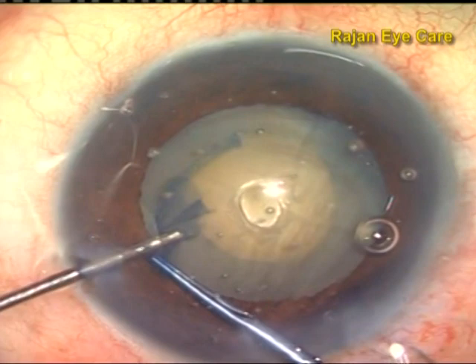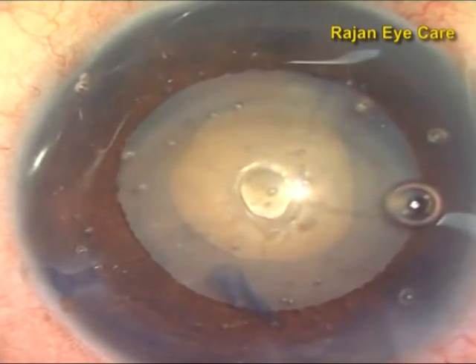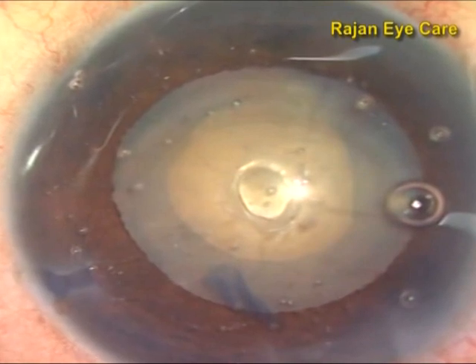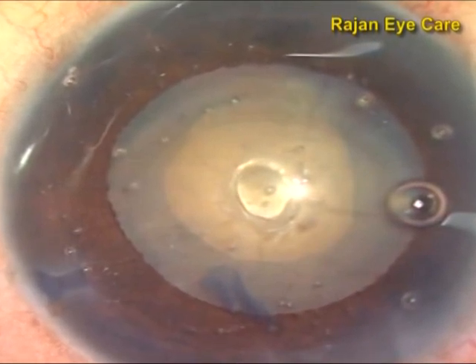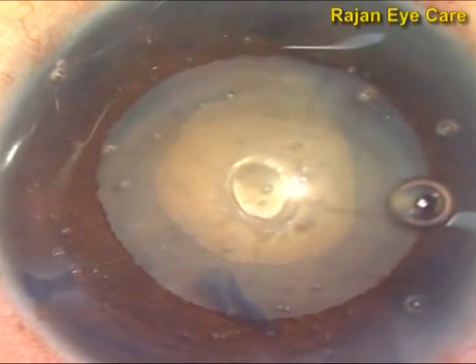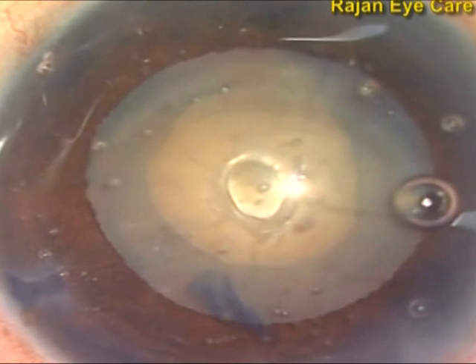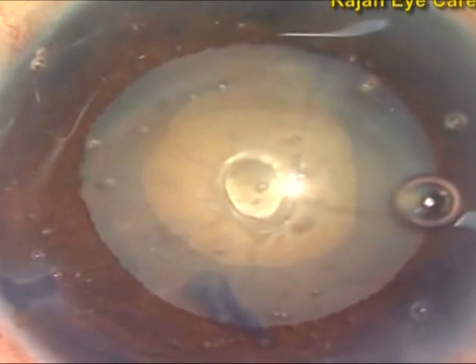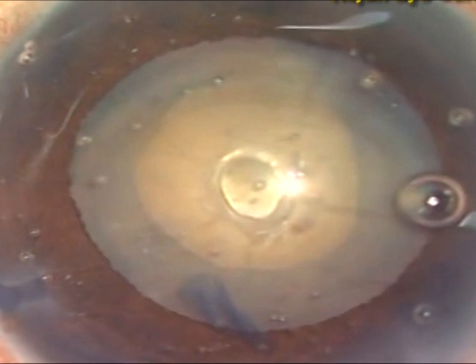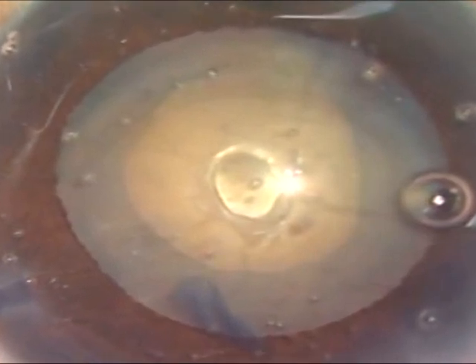If you notice the center of this particular nucleus, there is a small debulking area which has been caused by the sudden phaco burst, and this has actually helped in reducing the intralenticular pressure. The rhexis is round, and you can complete the rhexis in the usual way with the Utrata forceps or with the needle, whichever you are comfortable with.